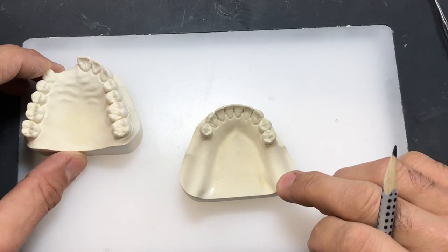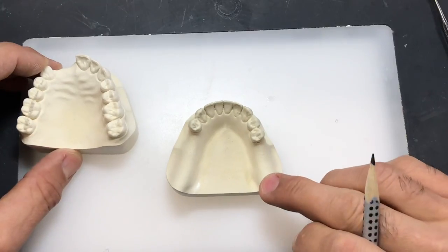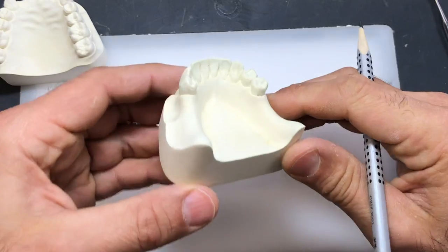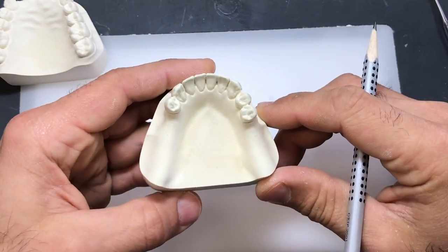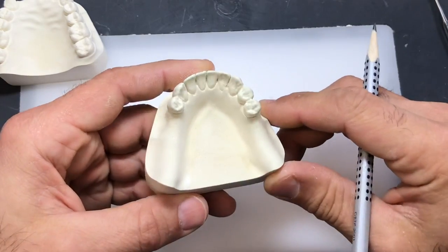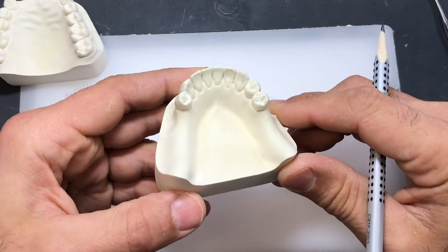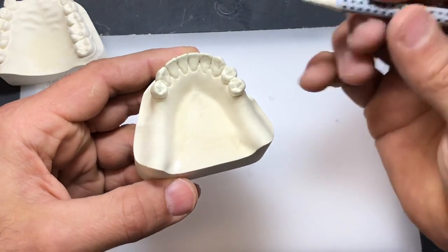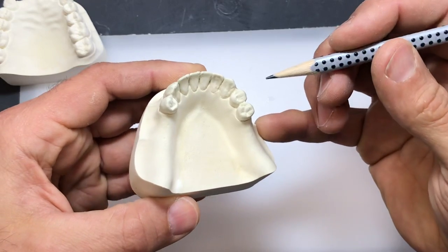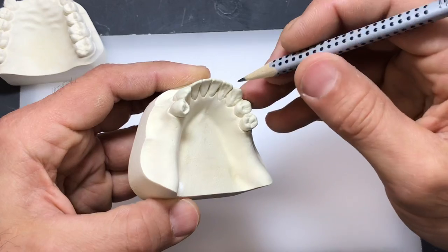I like to fabricate the bite block on the duplicate model to prevent any damage to the master cast. We need to survey this model in order to fabricate the bite block, but it doesn't have to be done the way we did it for surveying design purposes and bending wires. It can be very simple — you can hand survey this model. You don't have to put it on the surveyor; you could, but you can get pretty close by hand surveying it.